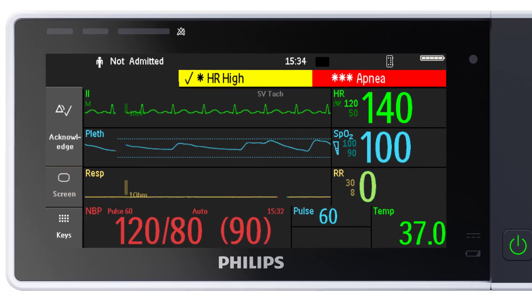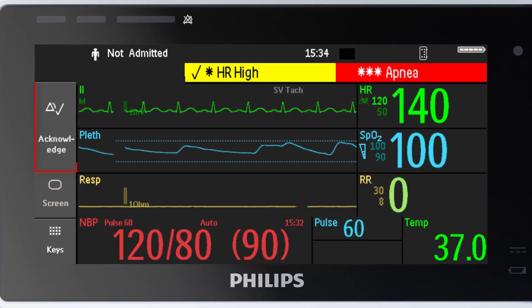These are the screen keys. This key is to acknowledge alarms. This is the main screen key. And this is the key to access all smart keys.